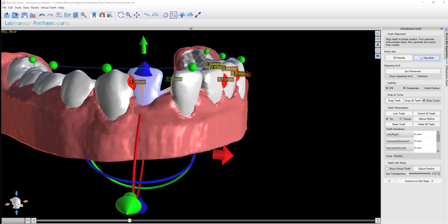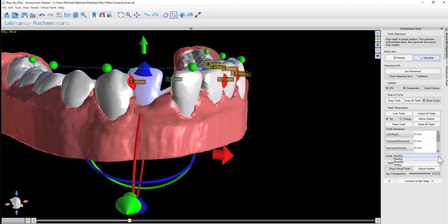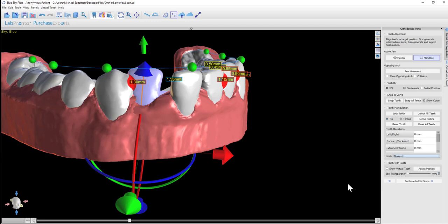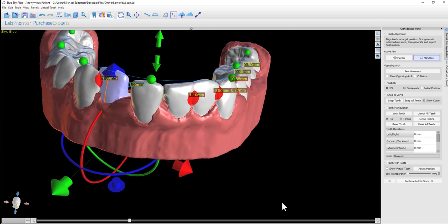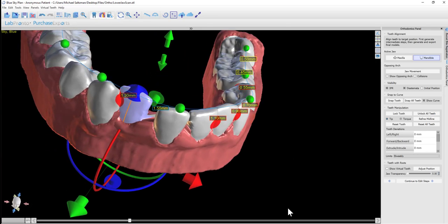The limits are important because when the software is creating and calculating the number of models or the number of aligners necessary, it's based on the tooth movement maximum limits for each step. Those numbers are based on monthly limits, and if you change it to bi-weekly, the limits will divide by two and you'll end up with twice the number of models or aligners. The same concept for weekly. The software will divide the limits and generate the model steps accordingly.